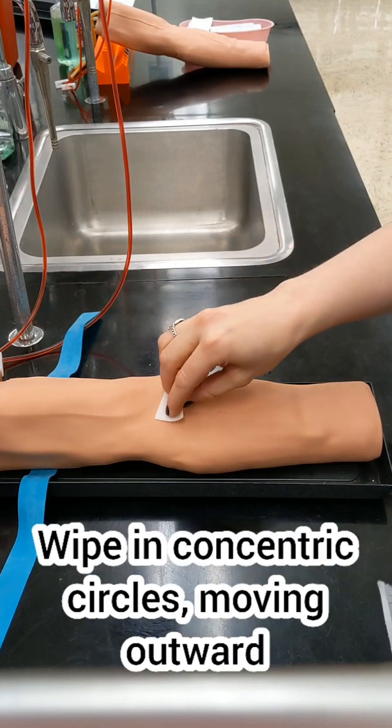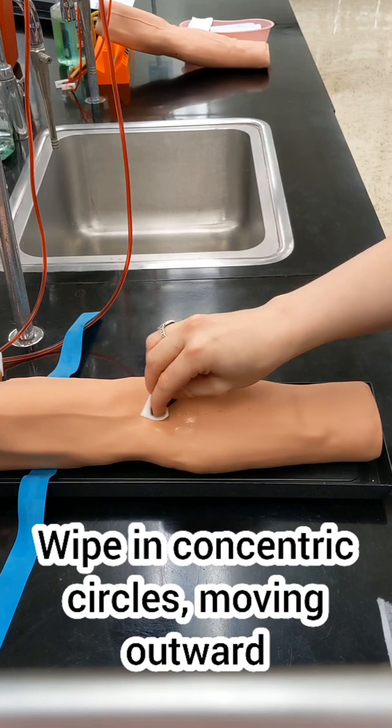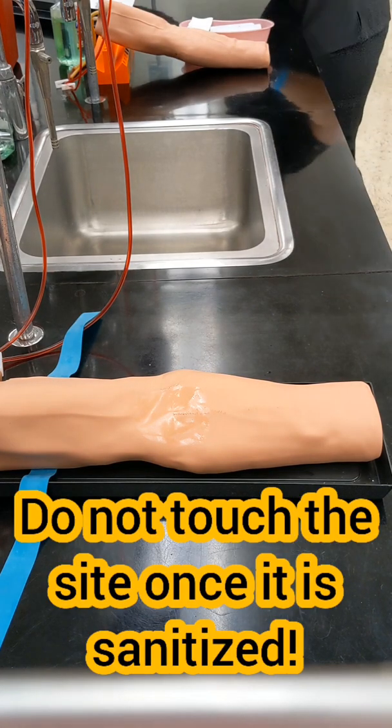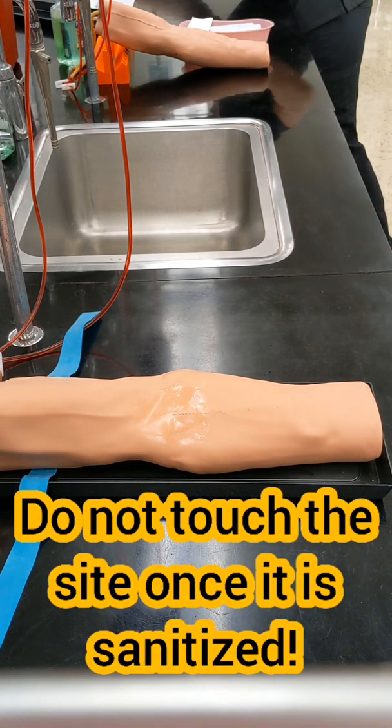When you prep the site, use an alcohol pad to wipe in concentric circles moving outwards. Once it is sanitized, you do not want to touch it. You want that site to be as clean as possible when you're putting that needle into the skin.